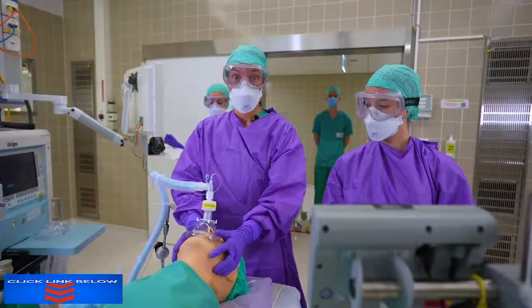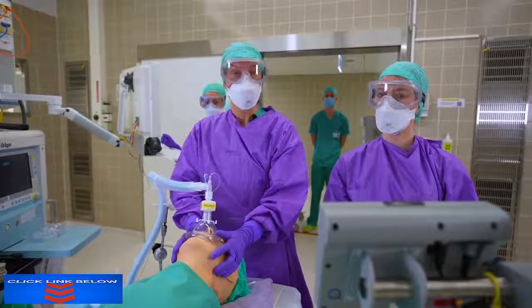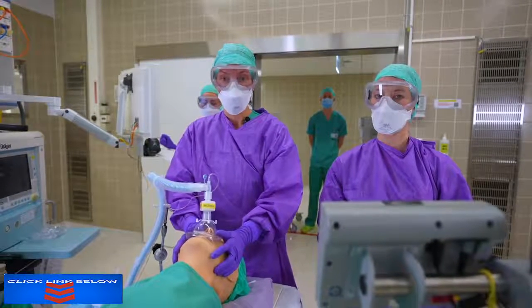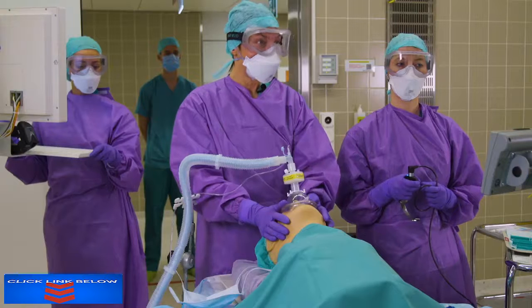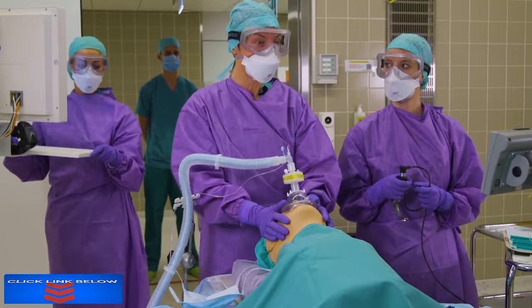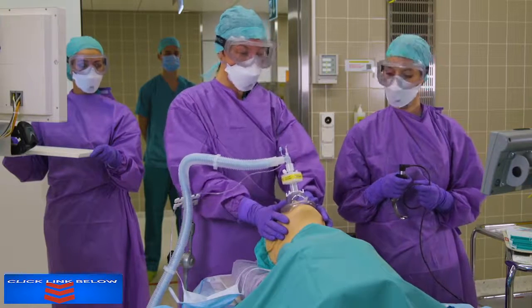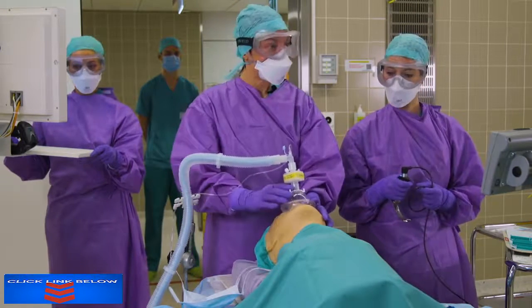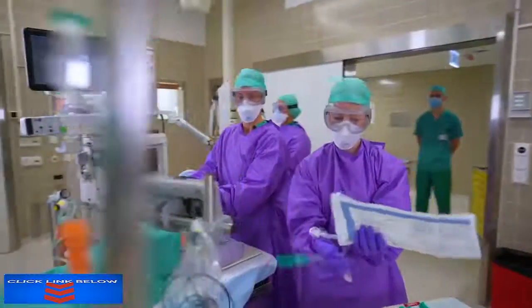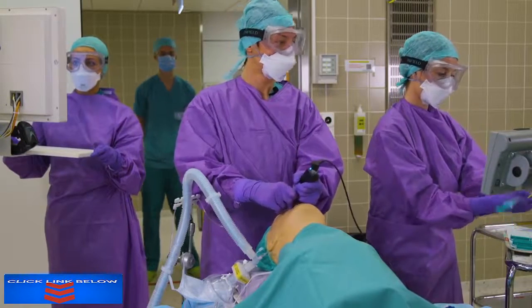After a thorough pre-oxygenation, we are starting our rapid sequence induction. RSI is used to avoid bag-masking the patient for prevention of aerosolization. Here, avoiding coughing with a thorough relaxation is also of utmost importance. We induce the patient and our patient is paralyzed. We are now intubating the patient with a video laryngoscope. We are utilizing an endotracheal tube with a stylet in place.